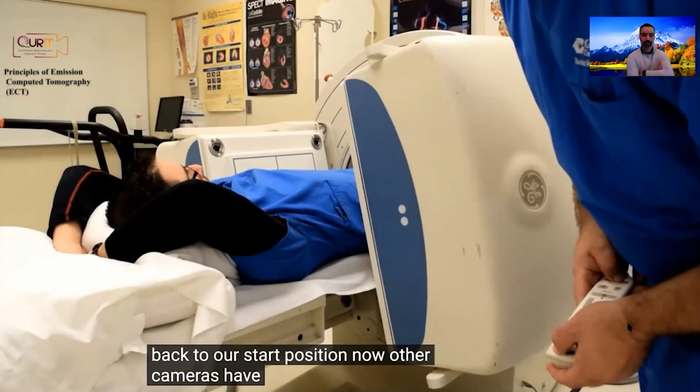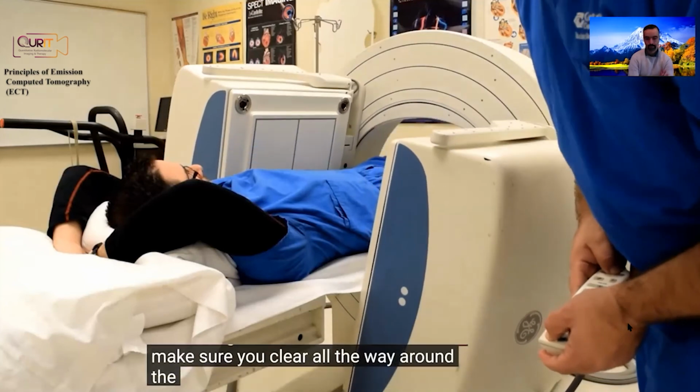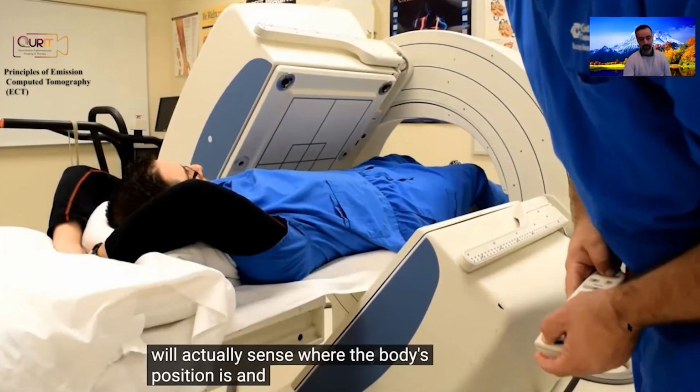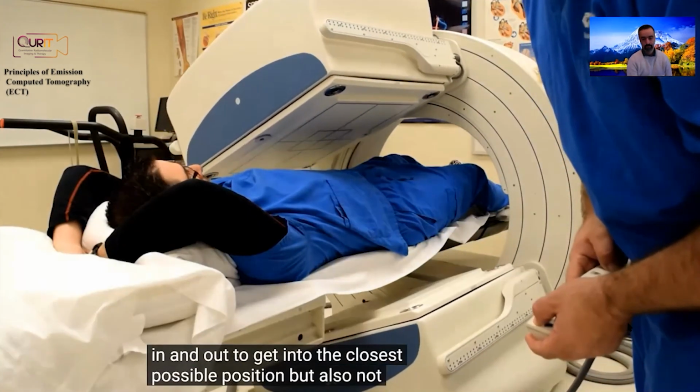Now, other cameras have what's called auto body contouring, which eliminates the need to make sure you clear all the way around. The camera itself will have sensors that will sense where the body's position is, and it'll move the cameras in and out to get to the closest possible position, but also not bump into the patient or the table.